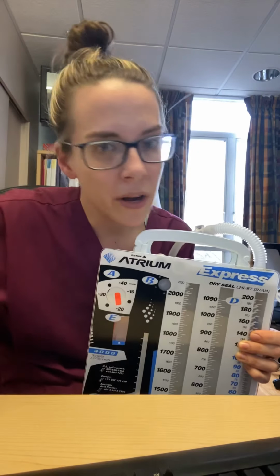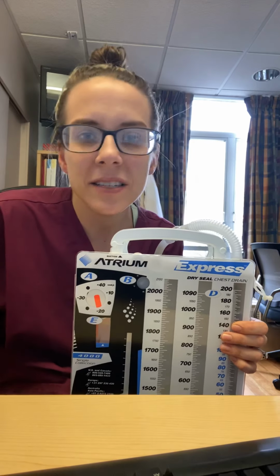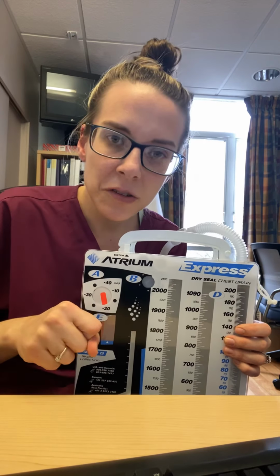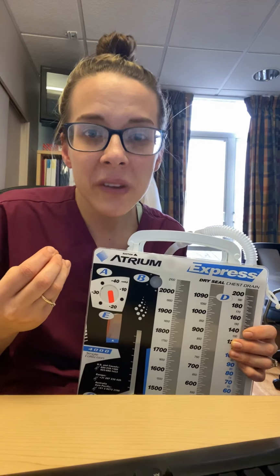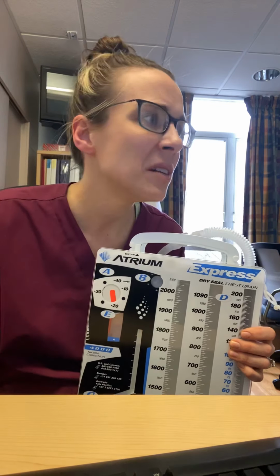If we don't see it, we're increasing the wall suction. This is a pearl, I wouldn't even worry about it. If somebody has a really big air leak that's not getting better, sometimes turning up the suction is the opposite thing to do because you're stenting open that hole. And sometimes we even convert them to water seal. Again, I might just delete that out of here because I don't want to confuse anyone. Don't worry about it.